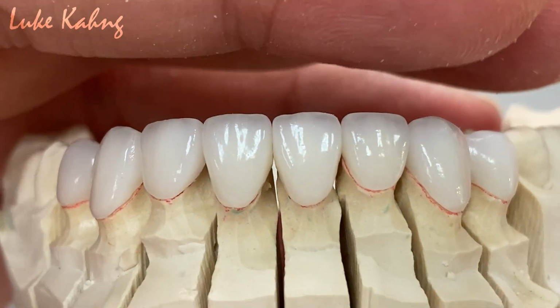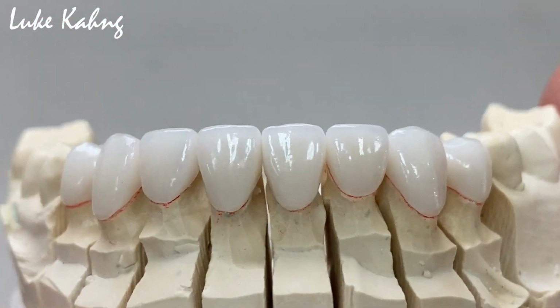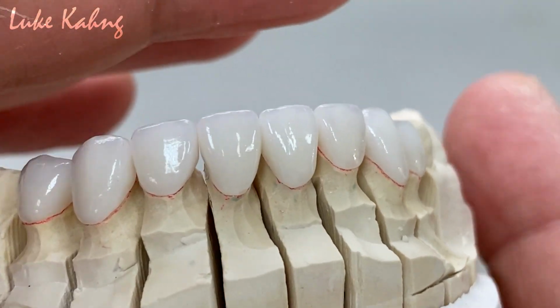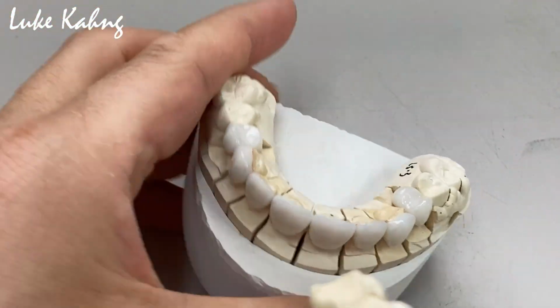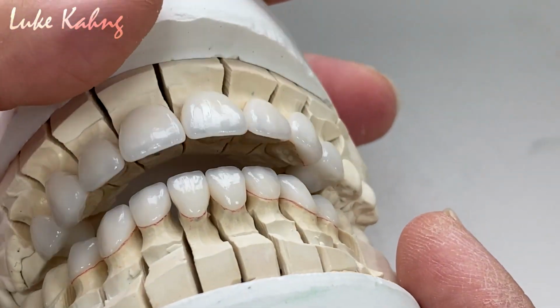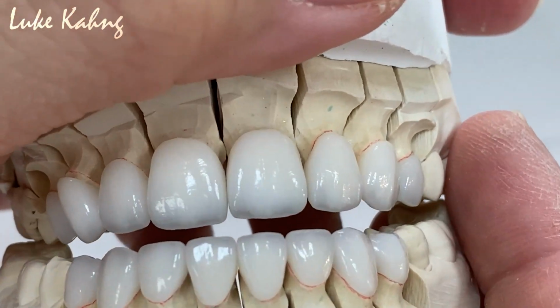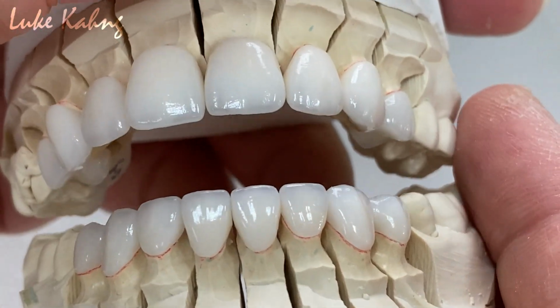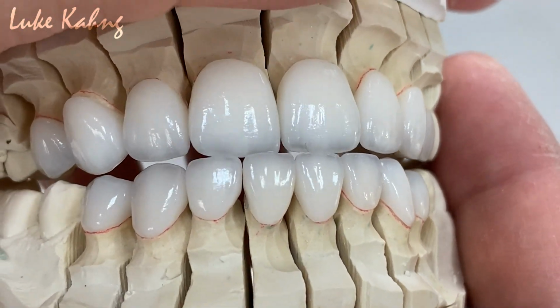And then this is our final veneer restorations, which is the height of contour, incisor embrasure, silhouette, and long axis. It's a great tool. And this one is the final case. We finish up the high-end cosmetic case. It's another lucky patient. Beautiful artwork from the laboratory.